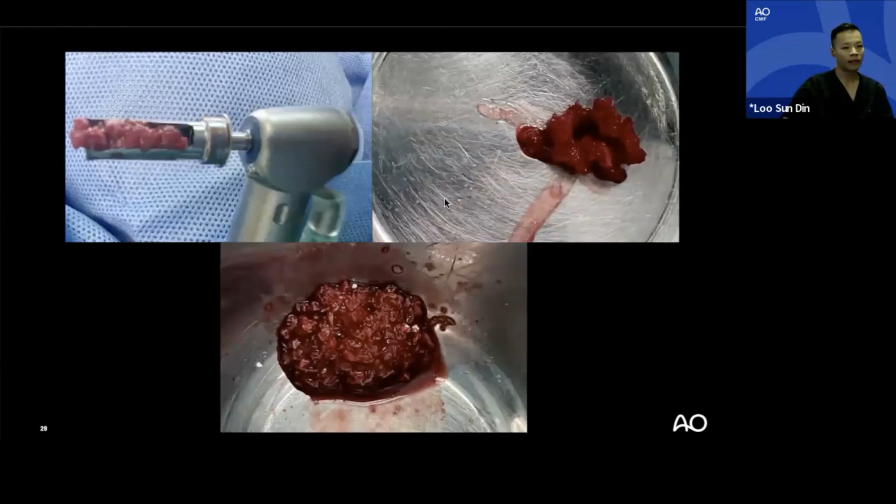And where do I harvest the bone? From the palatal using a bone collector. Each pass of the bone collector gives me this amount of bone, and each pass will take roughly a minute. I'll mix it with my xenograft or whatever bone substitute I want at a ratio of at least 50, but typically 60 to 70 percent autograft to 30 percent bone substitute and blood. What do I get in return? We get a pseudo quasi sticky bone. It's not a true sticky bone, but it's sticking together because the blood is clotting and it's easy to handle.